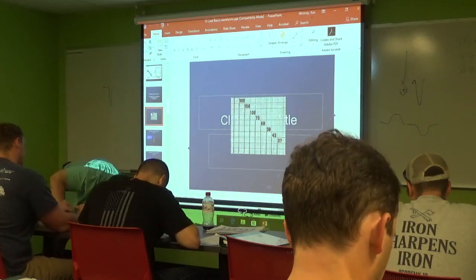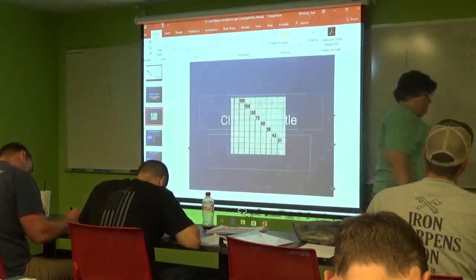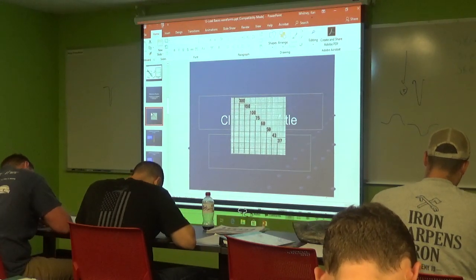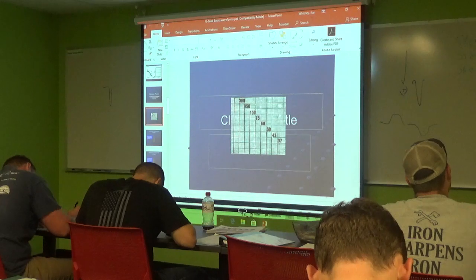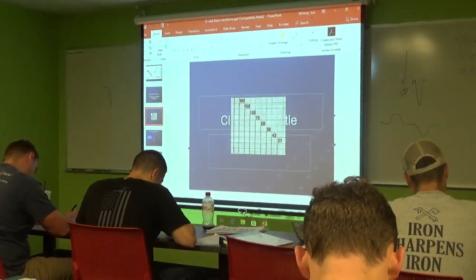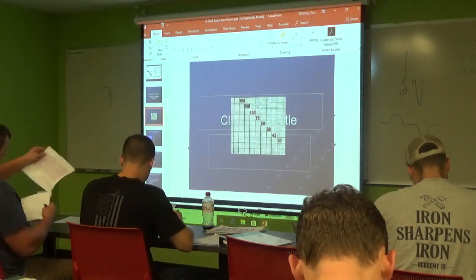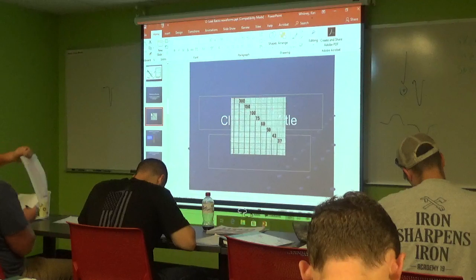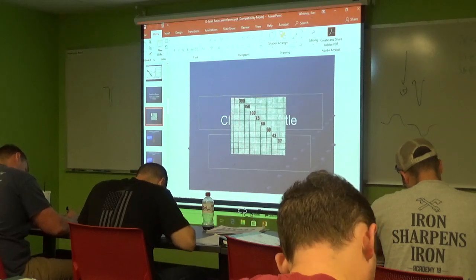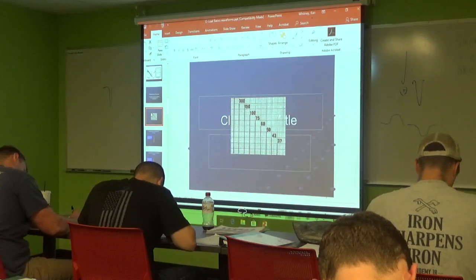First degree block, PRI 320, whatever it is. So 480 or less is normal QTC. There are parameters for other things, but for today we're going to use 480 as a normal QTC. So you're starting to learn to document your rhythm, your rate, your axis, and now your intervals. What do your intervals show you? If they're normal, put normal intervals. If they're not, what does that indicate?